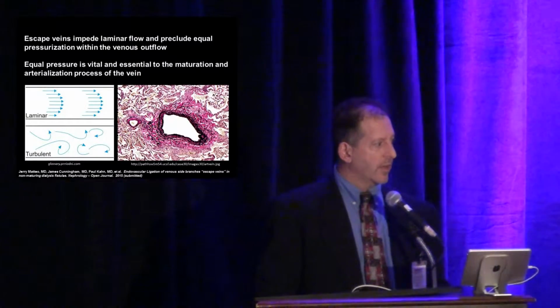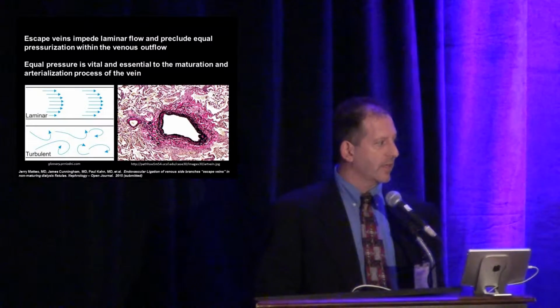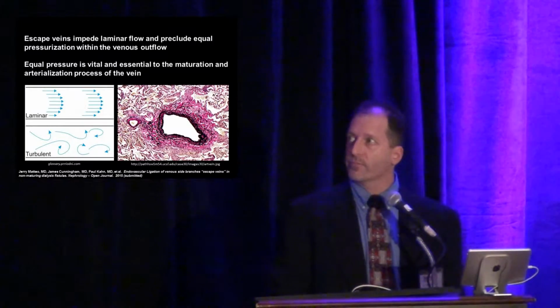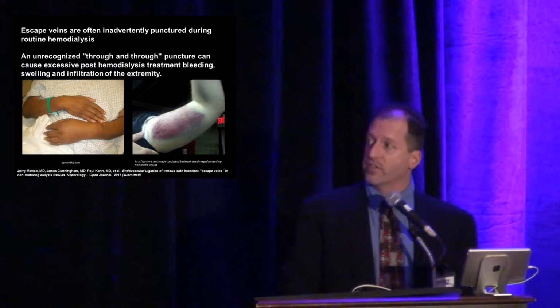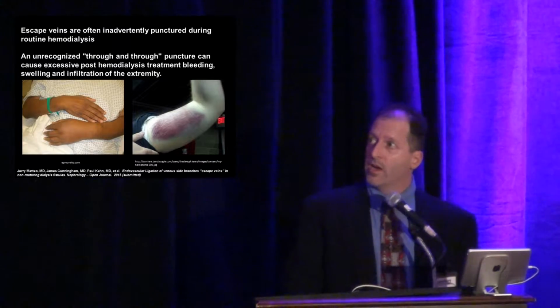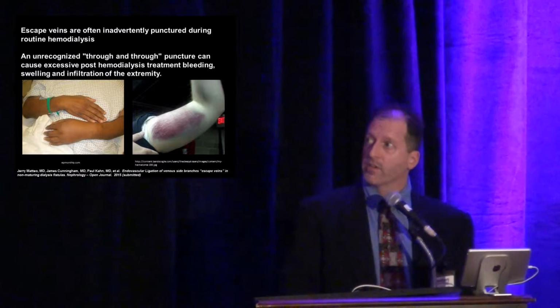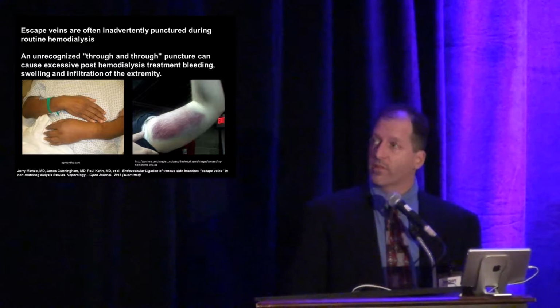Escape veins impede laminar flow and preclude equal pressurization within the venous outflow, and equal pressure is vital and essential to the maturation and arterialization process of the vein. So escape veins are often inadvertently punctured during hemodialysis. We've all seen these types of pictures before. Anytime an unrecognized through-and-through puncture happens, it can cause excessive post-hemodialysis treatment bleeding and swelling of the extremity.